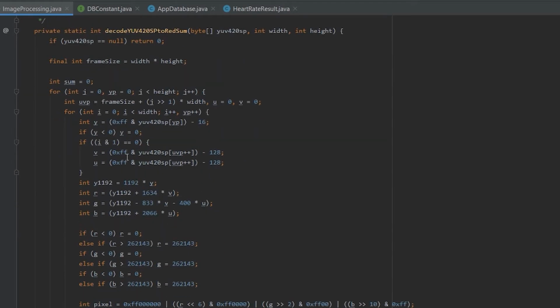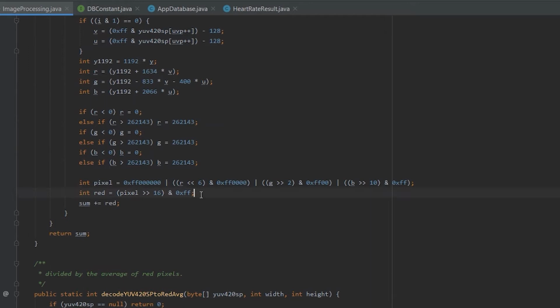This is the algorithm which is used to convert the YUV format to RGB format. It's an algorithm which is given by Android Studio itself. Then for our specific program, we're calculating the red pixels. Once it is converted to RGB, the pixel value is represented as a hexadecimal value. The first two hexadecimal digits are for red, the next two for green, and the next two for blue. By ANDing it with 0xFF, we are only taking the red values of the pixel.